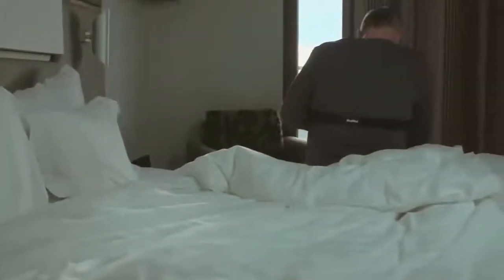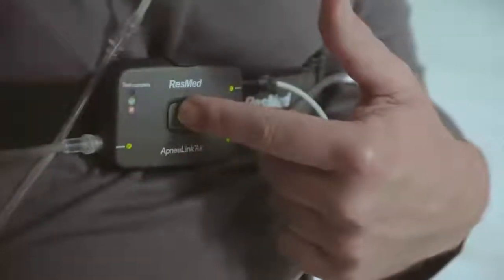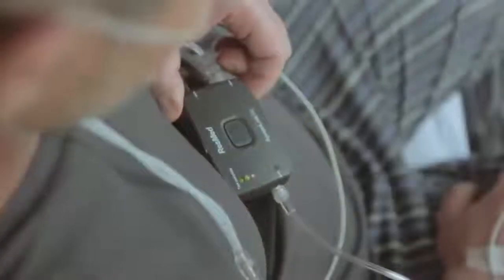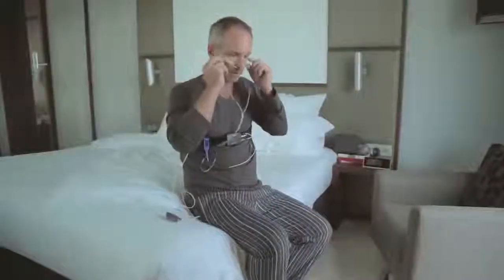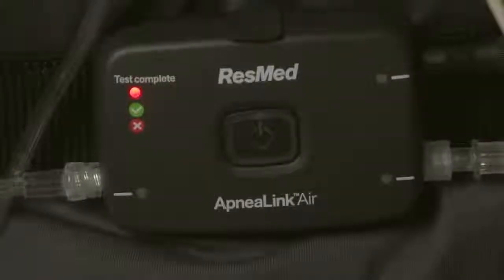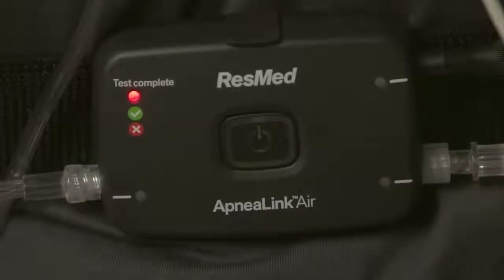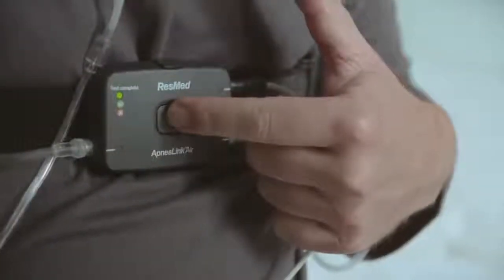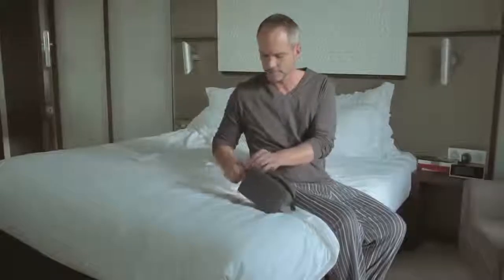When you wake in the morning, turn the recorder off by pressing the button for three seconds. The light will turn off. If the test complete light goes green, you have successfully completed your overnight study and can now return the device to your healthcare provider. If the test complete light is red, contact your healthcare provider, as the test may not have been successful. Press the on-off button another time until the test complete light turns off, and return the ApneaLink Air system to your clinician for the analysis.